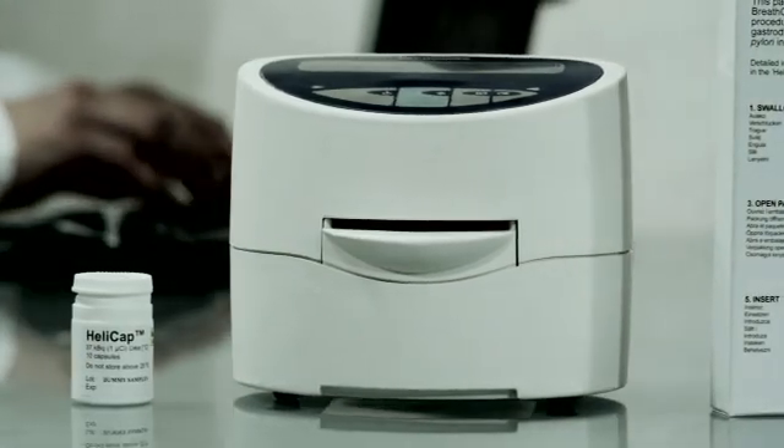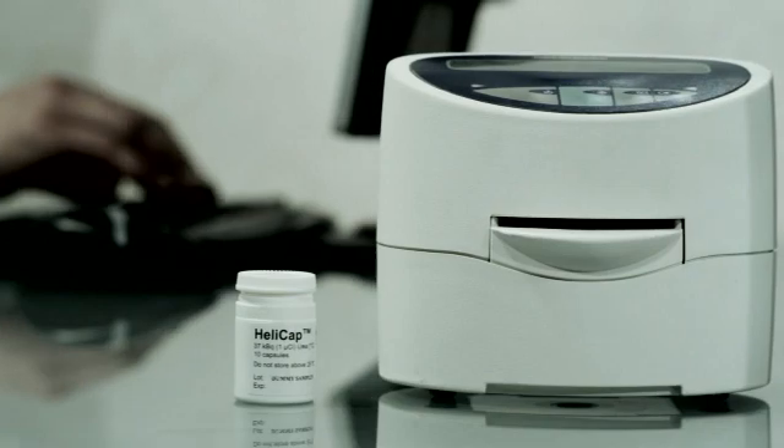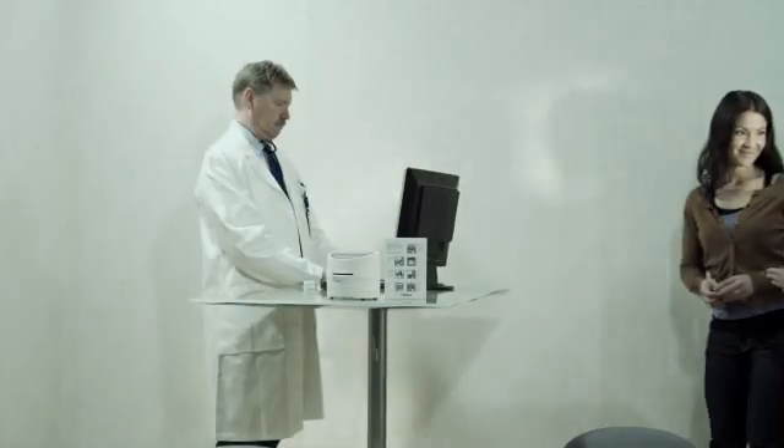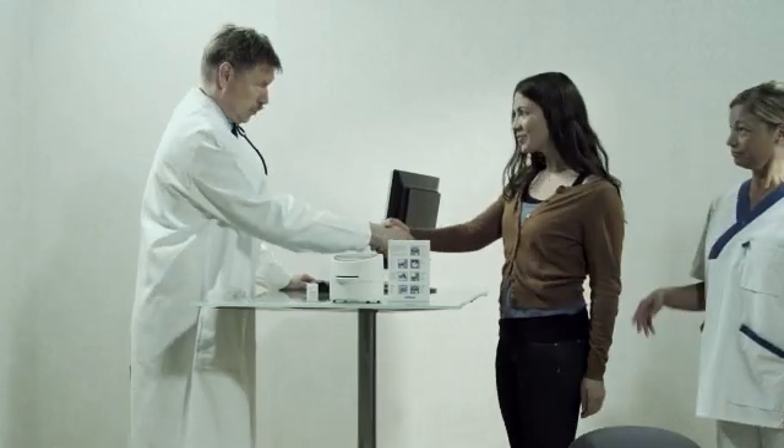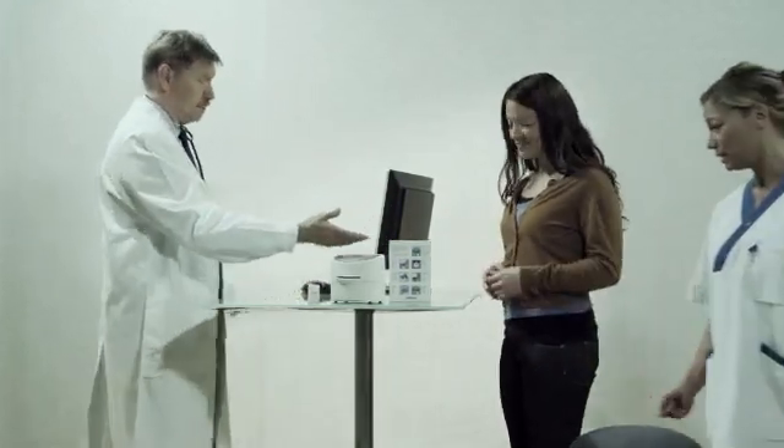The Heliprobe system consists of a HeliCap breath card and a Heliprobe analyzer. Make sure the Heliprobe analyzer has been properly installed and is ready for use.